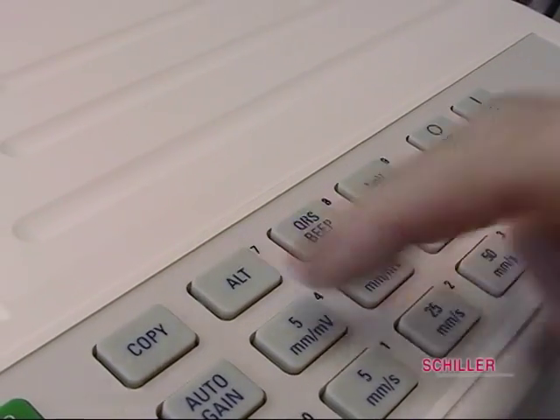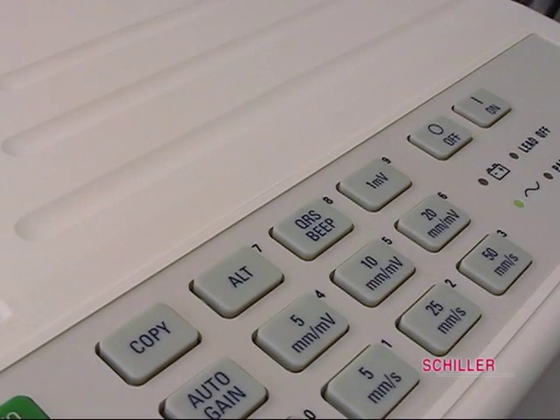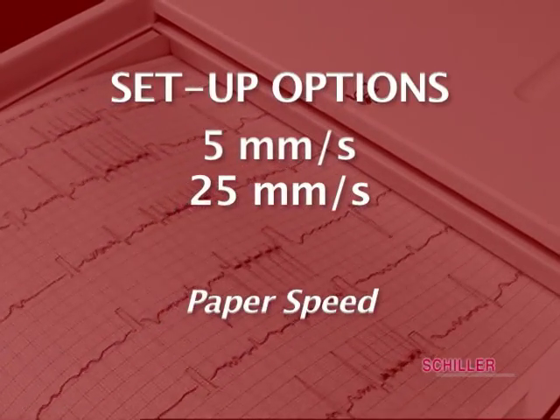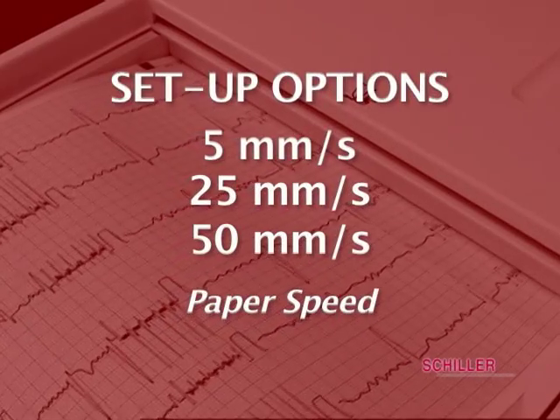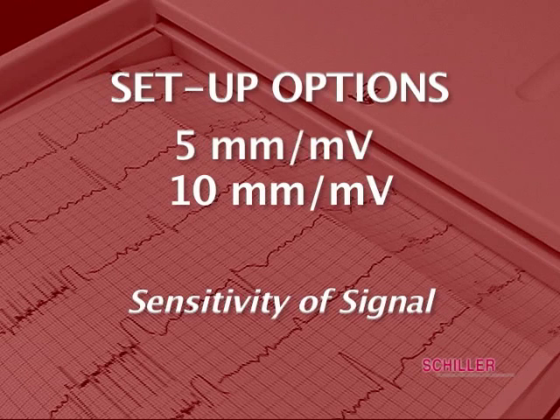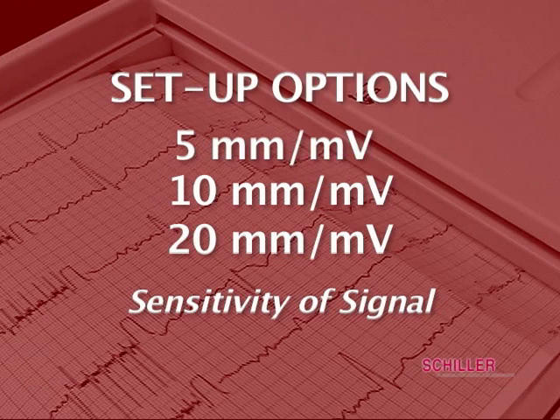The ALT key is used for initiation of setup options. 5 mm per second, 25 mm per second, and 50 mm per second are used for paper speed. 5 mm per millivolt, 10 mm per millivolt, and 20 mm per millivolt are to select sensitivity of signal, only for manual print.